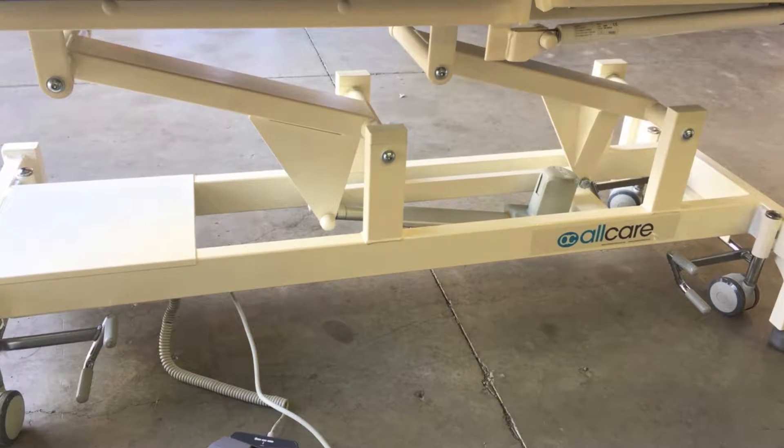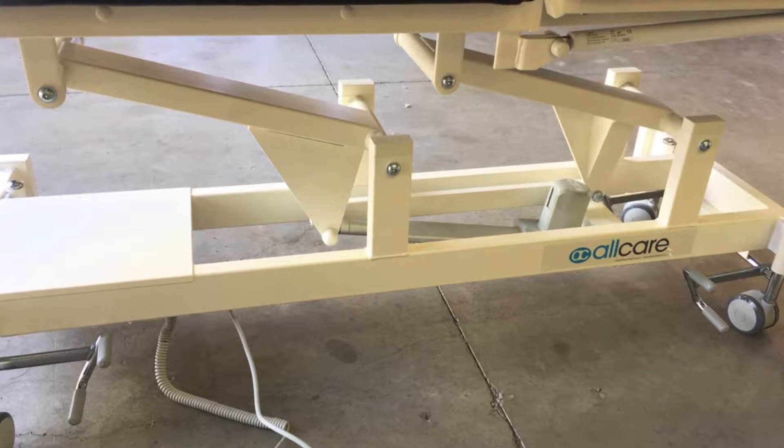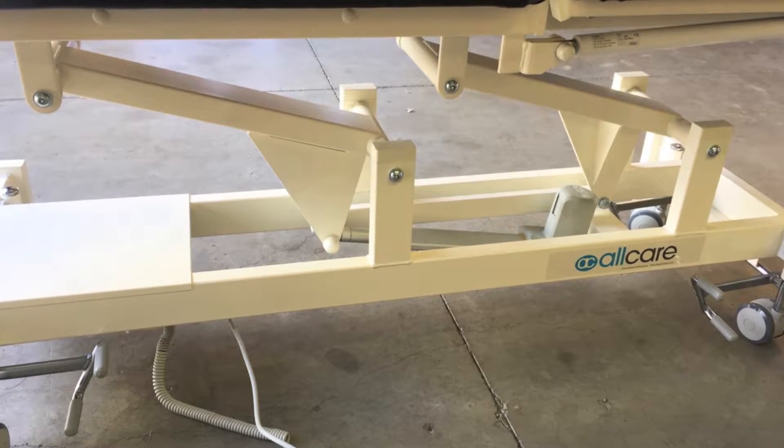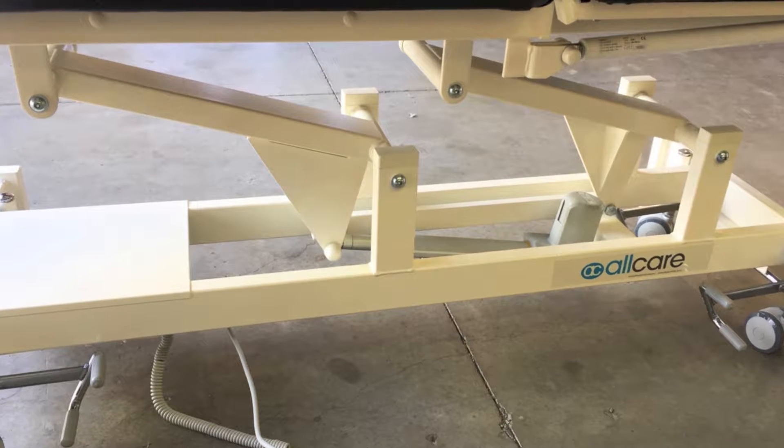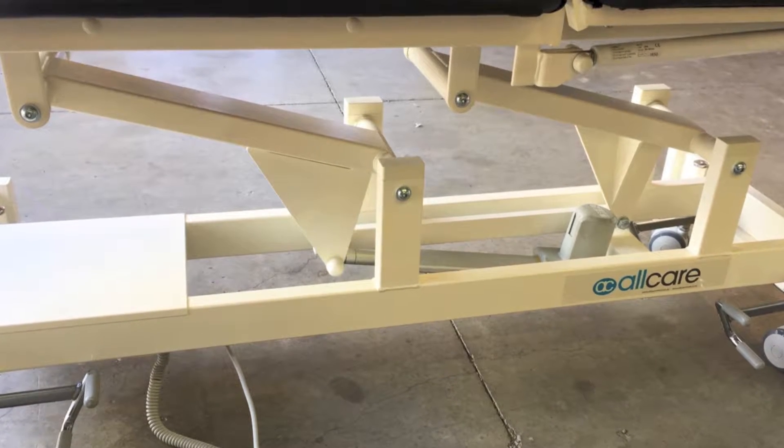Servicing of all care treatment tables. The moving components of beds require to be serviced from time to time. If you experience any noise from your bed, it is likely to require a simple adjustment of these moving parts.